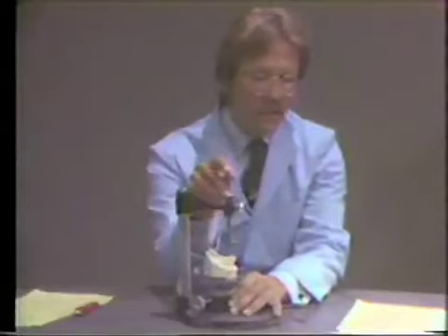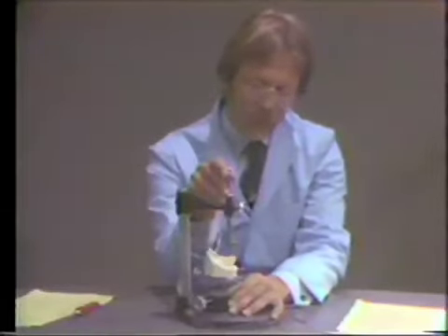Now I'm going to look at the distal aspects of the tooth, the terminal abutment teeth, to check the heights of contour there. And I can see, if I look at the distal surface of that abutment tooth on the surveyor, that I have a fairly parallel surface, and if I apply blockout wax at the blockout phase, I can create a little space in this area to allow for movement of the partial toward the abutment tooth without pushing that abutment tooth forward. This contour I can work around very nicely.